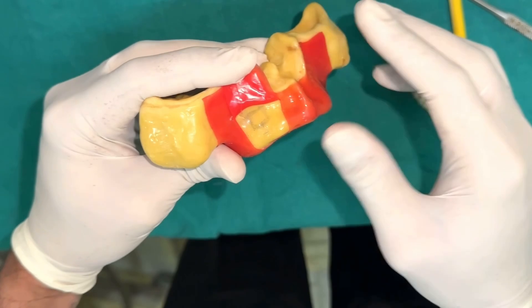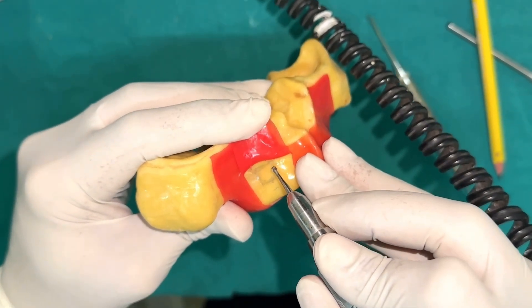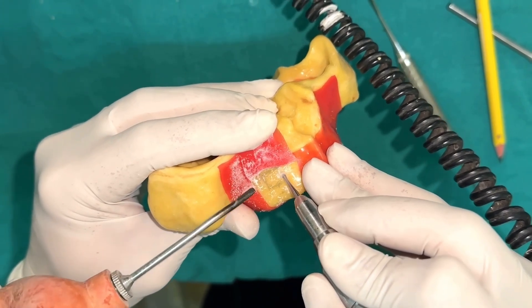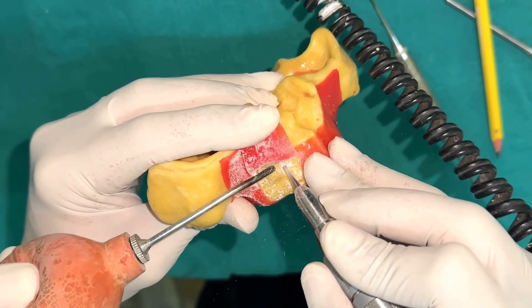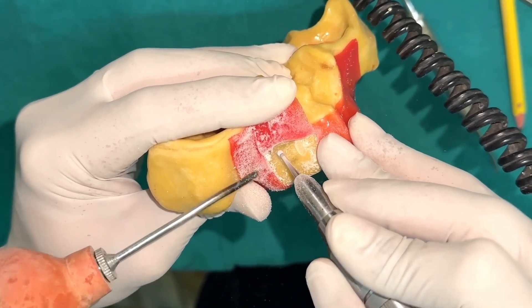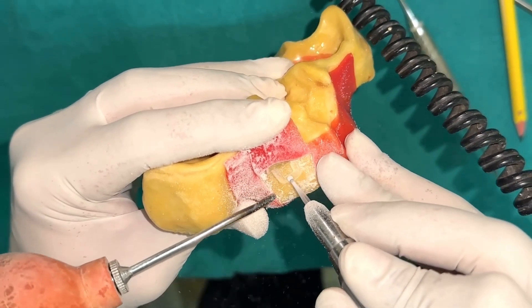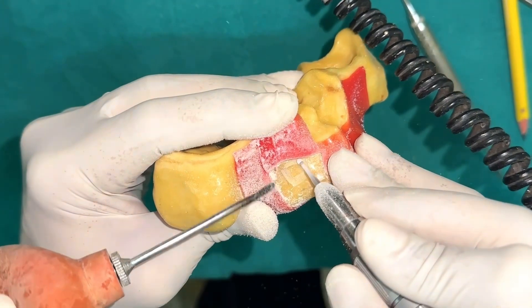Once the window has been marked, for demonstration purposes we will be using only the micromotor. In the patient's mouth we don't use a chip blower — there is suction — but here we use a chip blower. What we are trying to do is use a shaving motion to remove the bone. Feather strokes have to be used — very gently — because if we push it inside, that will lead to perforation of the Schneiderian membrane in the patient's mouth.